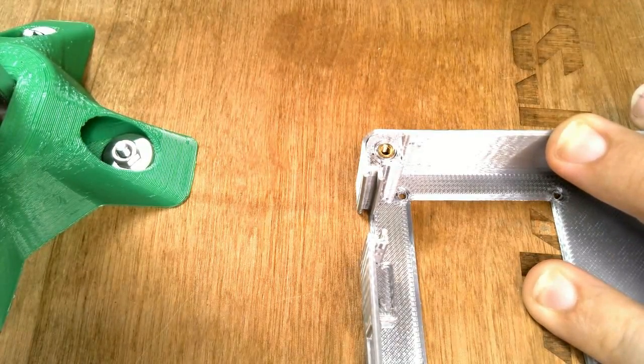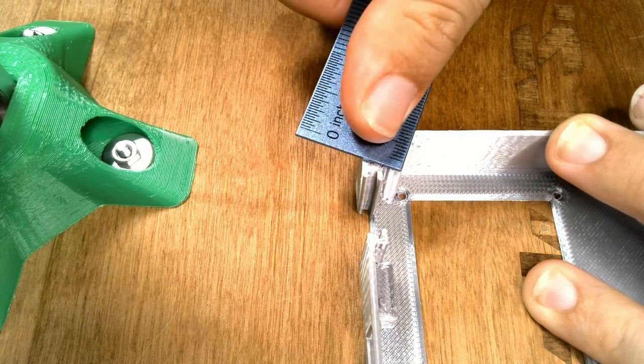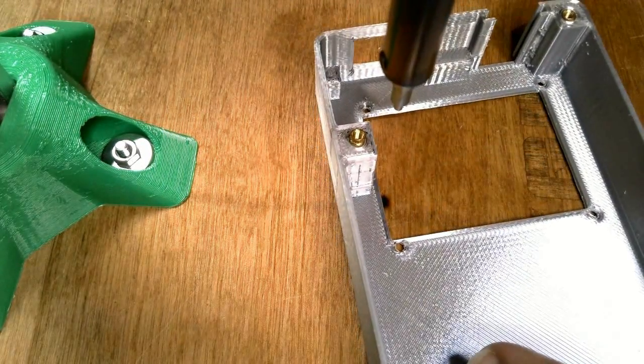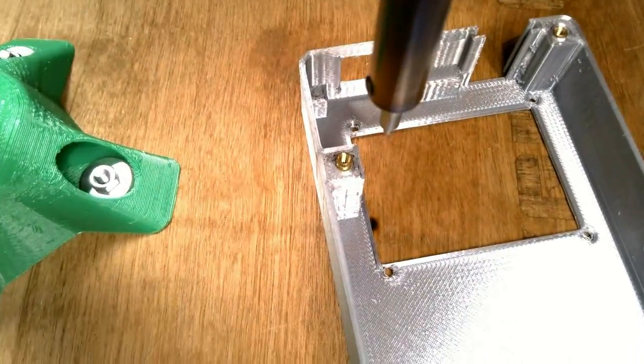To ensure that the insert is flush with the case, press down on it with a piece of metal, like this metal ruler. Repeat the process for the other 3 inserts.